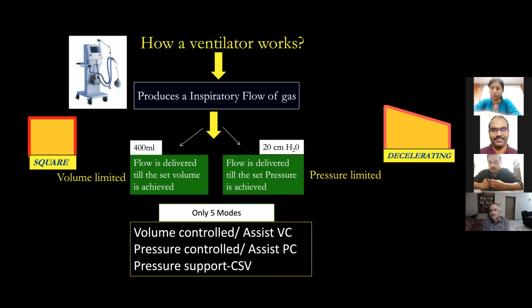Both of volume. Which are the modes which have a decelerating flow? Pressure control, assist pressure control, as well as pressure support also. All three of them have decelerating flow. Which is more comfortable to the patient? Volume limited or pressure limited? Pressure limited is more comfortable, sir.